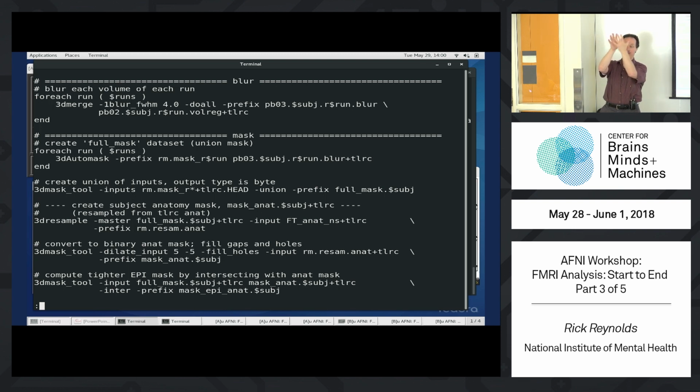Even with nonlinear, in one case you could have 4 lobes, in another 3, and what do you do? So registration across subjects isn't perfect. There's still anatomical variability, and so the other purpose of blurring is to make this blob and this blob bigger, so the overlap gives you a better group result. But with nonlinear registration, the better we do registration, the less you need blur for that reason.